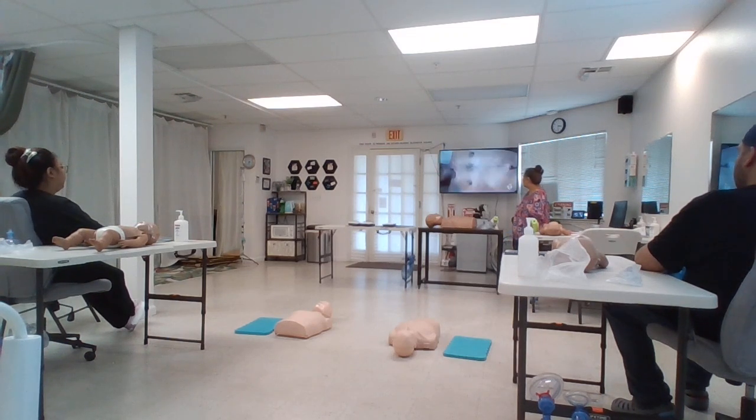Excessive water on the victim's chest can also be a problem. It could allow the shock to travel through the water between the pads, ultimately preventing delivery of an effective shock dose to the victim's heart. If a victim is lying in water, quickly move them to a dry area before using an AED. But if the victim is lying on snow or in a small puddle, you can use the AED. And if the chest is covered with water or sweat, wipe it off before attaching the AED pads. But wipe the chest quickly. It doesn't have to be completely dry.